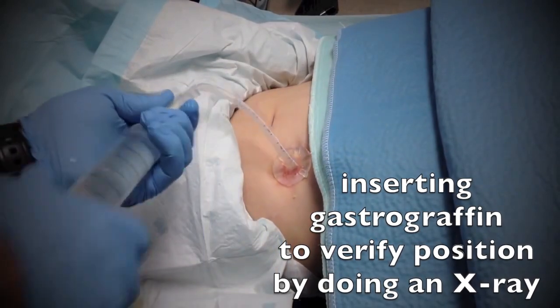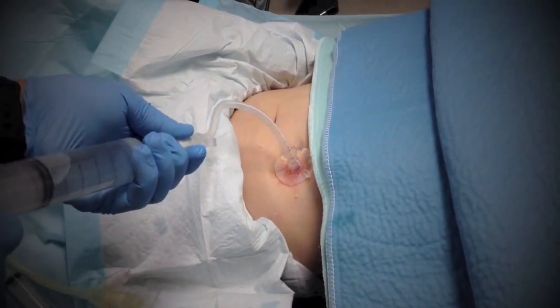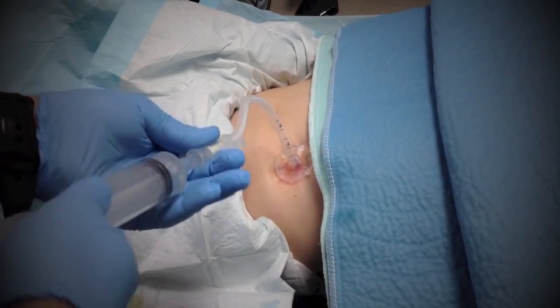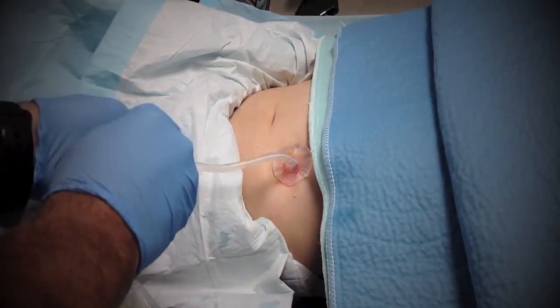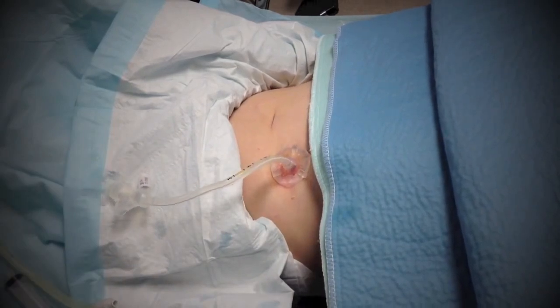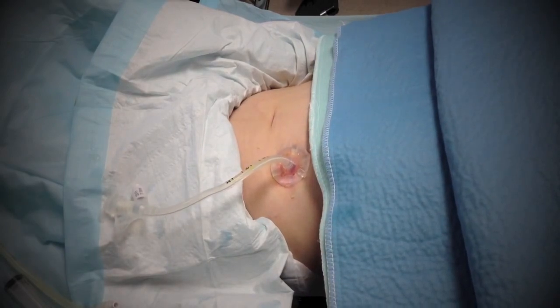And one thing we should do is aspirate. There's gastric contents coming through the tube, and then we go ahead and push. And then when we do the X-ray, it's just going to show that. Maybe keep that one. You may. The water's moving. We've got to wash it or something. Oh, that's all right. And that's it. The tube is replaced now.